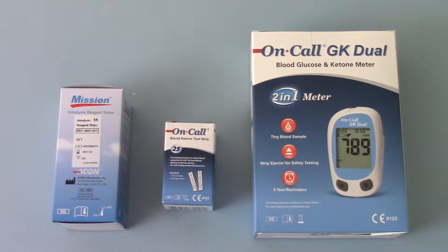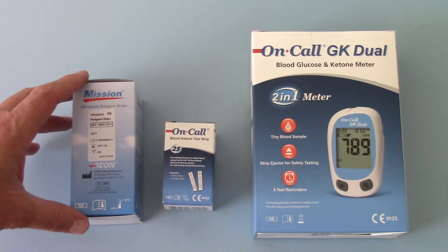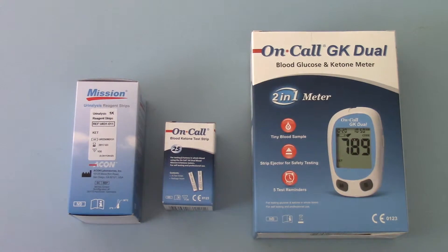The other option for ketone measurement is to use a urinalysis test strip such as the Mission 1K ketone test strip shown here. These are single pad dip and read urine tests that come in vials of 100. The main advantage is they're low cost and easy to use as a non-invasive urine test, but they will only detect ketones once levels have reached quite a high level and are being excreted into urine.